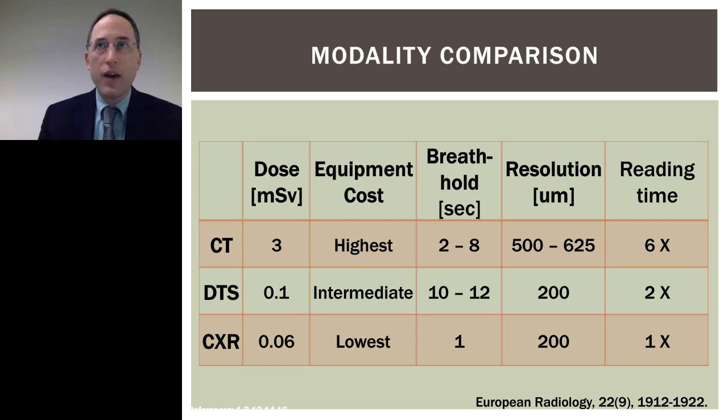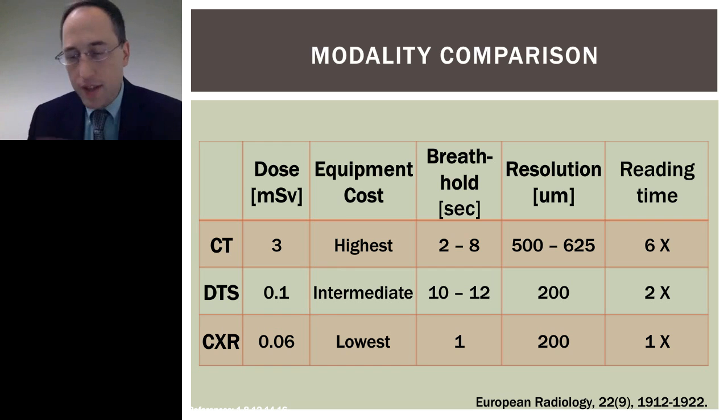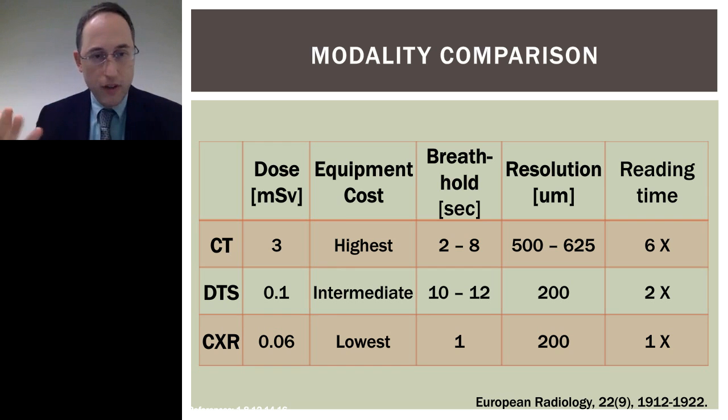Now, people have asked me, yes, you show these numbers, but what about submillisievert chest CT and all these other reconstruction methods and all the dose people are dropping? I understand that, but tomosynthesis still is far less in dose. And additionally, all of the iterative reconstruction algorithms that are used in CT can be applied to tomosynthesis.